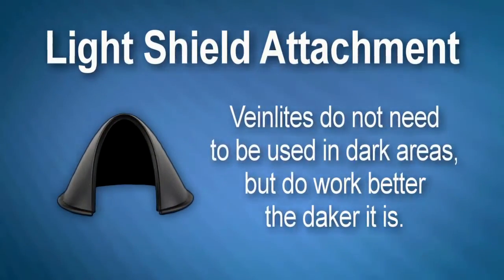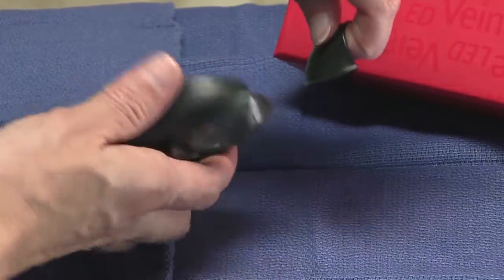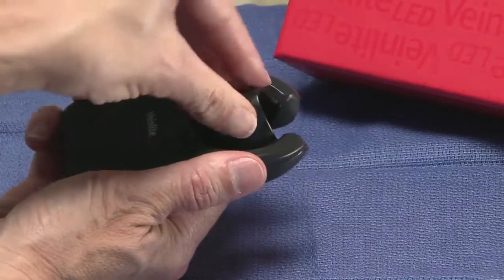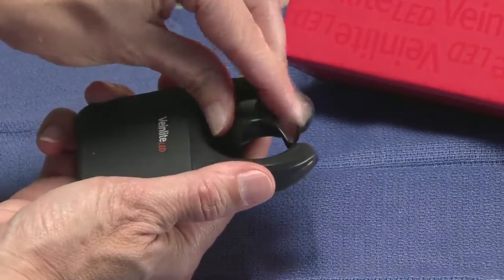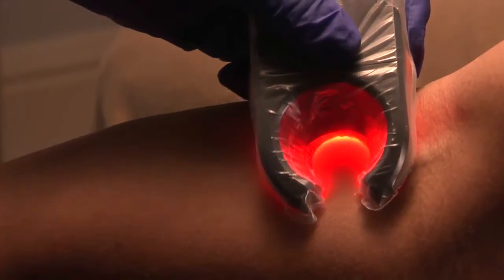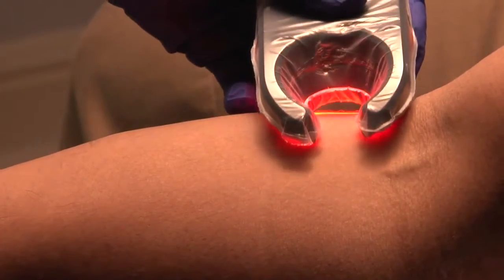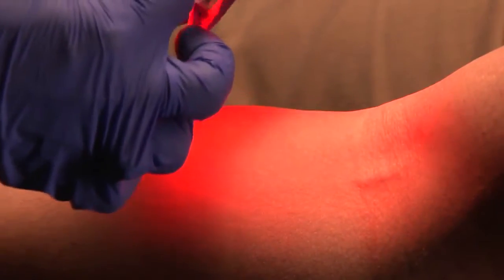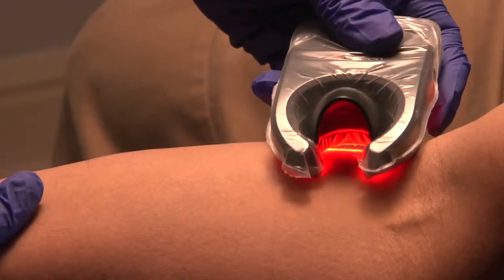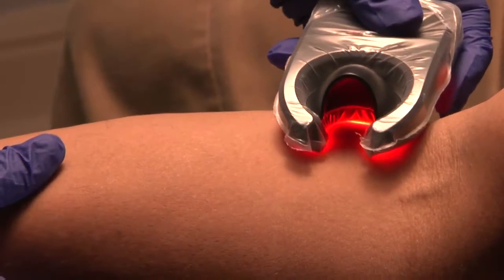Your VeinLight comes with a light shield. To apply this attachment, place it on the opposite side of the LEDs in the vein imaging area. This attachment swivels 360 degrees, allowing optimal viewing when scanning for the vein. The light shield is used if the ambient or overhead light is too bright, cannot be dimmed, or when used in direct sunlight. The light shield attachment will significantly minimize overhead light, providing much higher contrast and visualization to the vein imaging area.